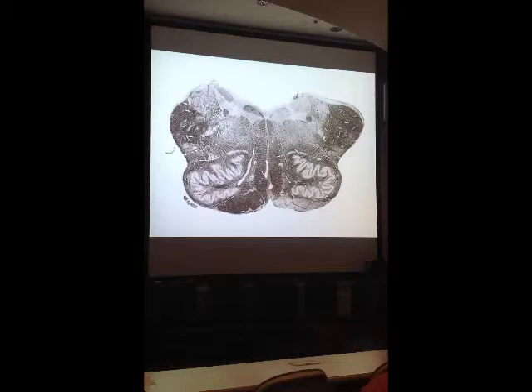It's not quite as well formed over here, but right next to the inferior cerebellar peduncle there's spinal trigeminal tract and spinal trigeminal nucleus. It's a little less clear over here, but that area there is spinal trigeminal nucleus and then spinal trigeminal tract. Again, fourth ventricle. On your slide list, I have listed the hypoglossal nucleus, the dorsal motor nucleus of the vagus, and this is still some vestibular nuclear complex.